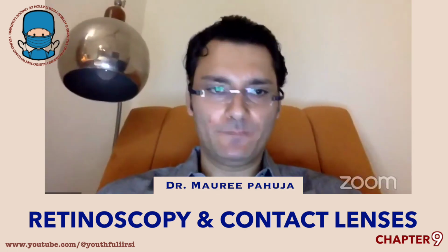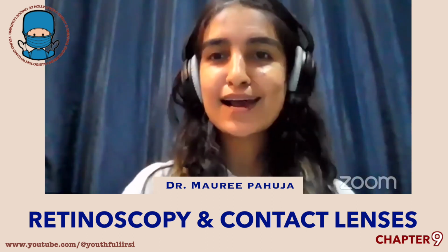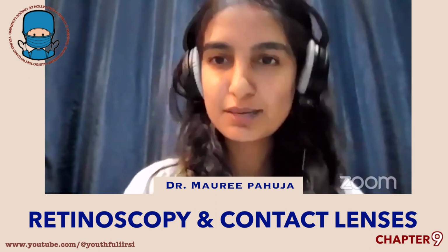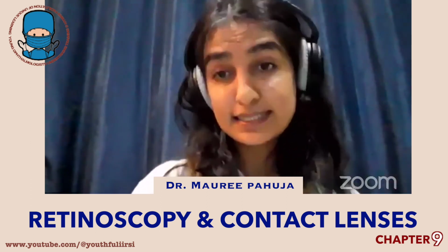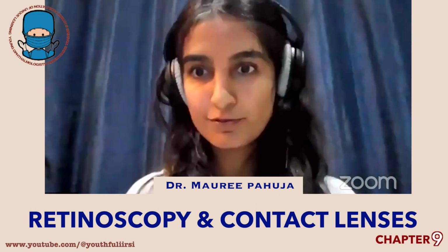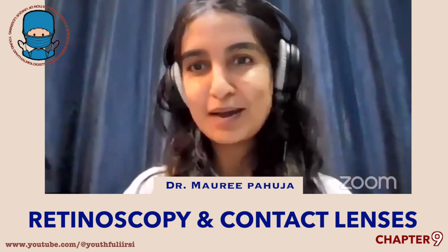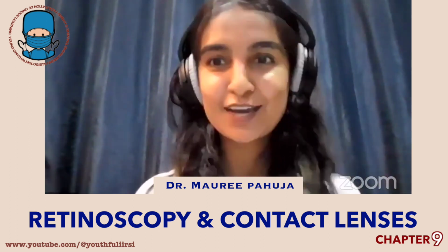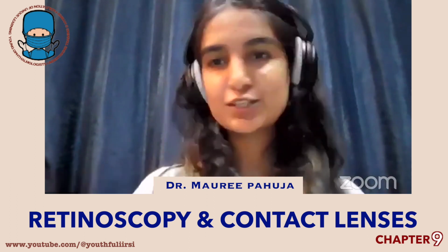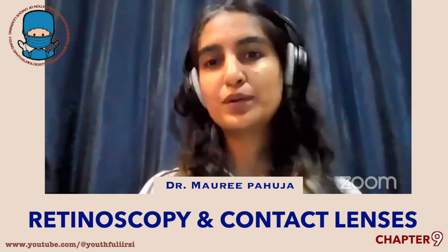Thank you. Also, if I may humbly add another thing, which I believe is a really important step, you cannot hurry this process at all. You can assign it to somebody at the hospital to let them know that these are the steps. Give the patients a stepwise guide and get a consent from them that I know what I need to do and that I'm going to follow the procedures, because you don't want to end up in complications when they have not taken care of their lenses back at home. You have informed them of all that is necessary, and yet the patients may not be compliant. So it's very important that you get a consent from them that I know what the steps are that need to be done in the process.